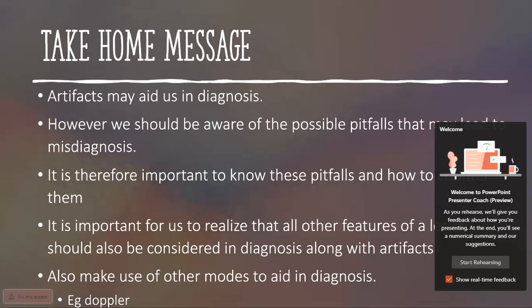The take-home message for tonight is that artifacts may aid us in diagnosis. However, we should be aware of the possible pitfalls that may lead to misdiagnosis. It is therefore important to know these pitfalls and how to counter them.